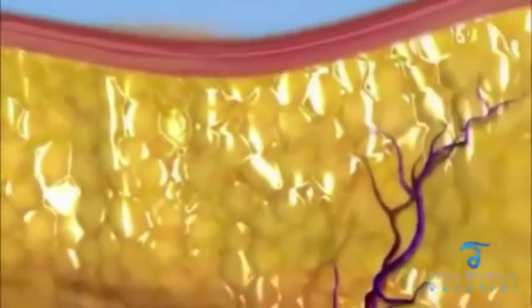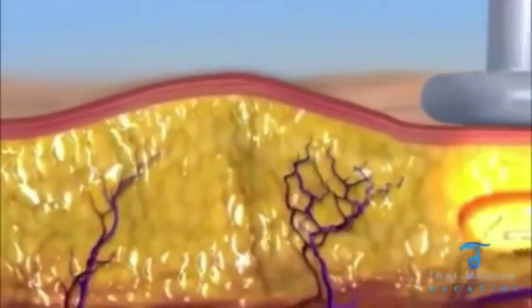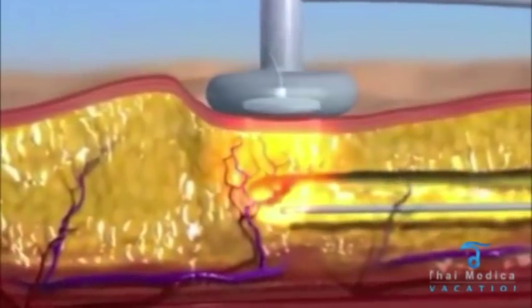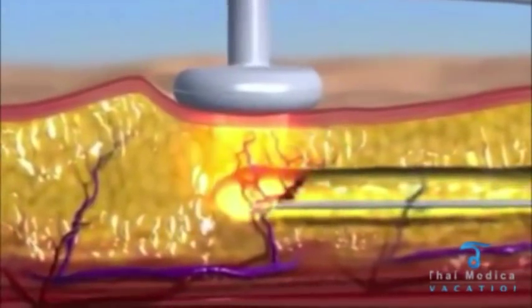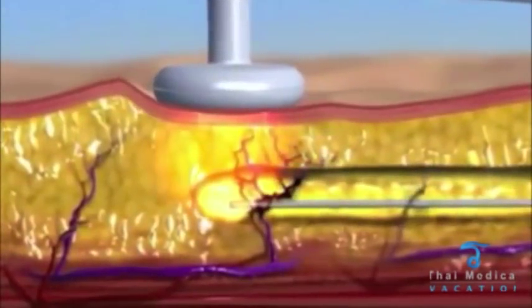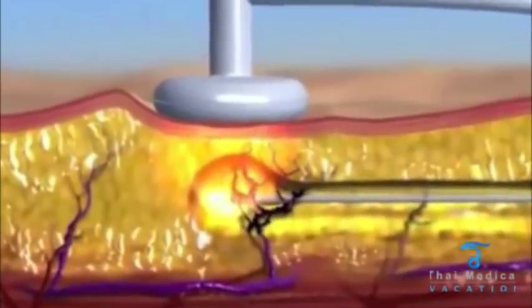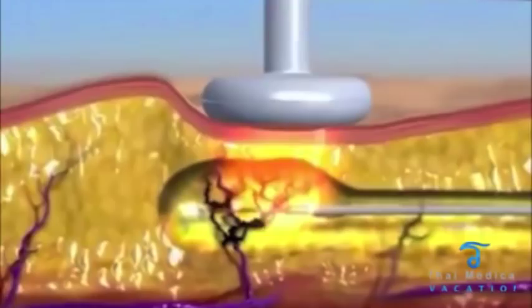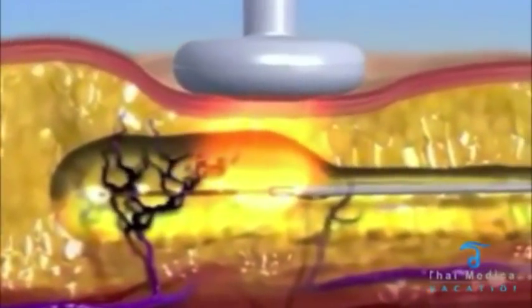The Body Tight contouring procedure uses radio frequency energy for fat liquification and collagen contraction. RF current flows from the internal cannula towards the external electrode placed on the skin surface. RF power is regulated based upon online measurements of skin temperature and tissue impedance.